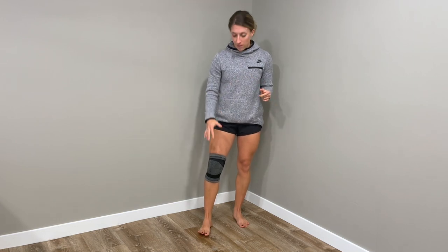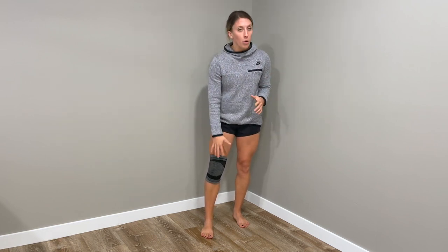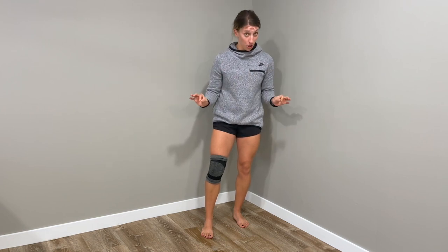These sleeves can also promote blood flow to the area, which can help promote healing, and they can minimize swelling — reducing that tightness or stiffness feeling where your knee feels like a cement block. There are many different benefits to these compression sleeves, and the good thing is there are really no risks unless you have circulation issues.